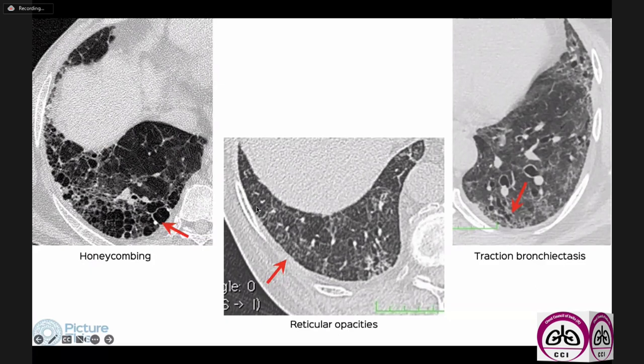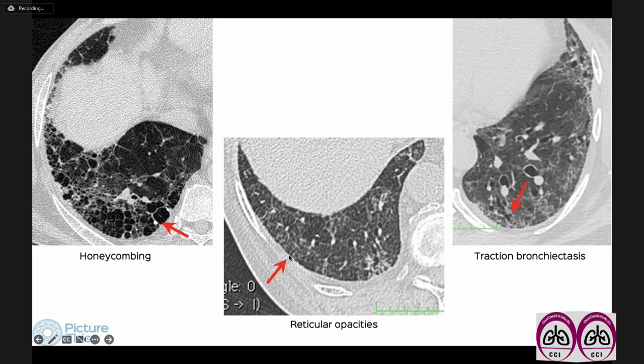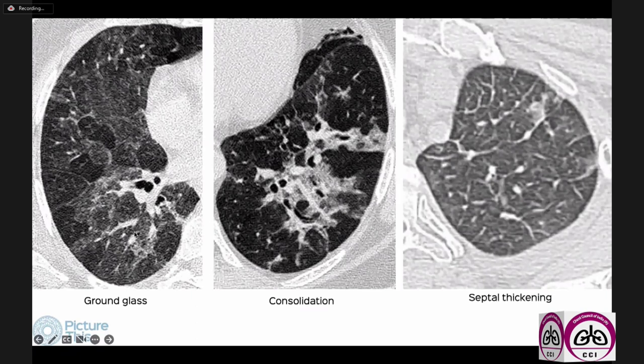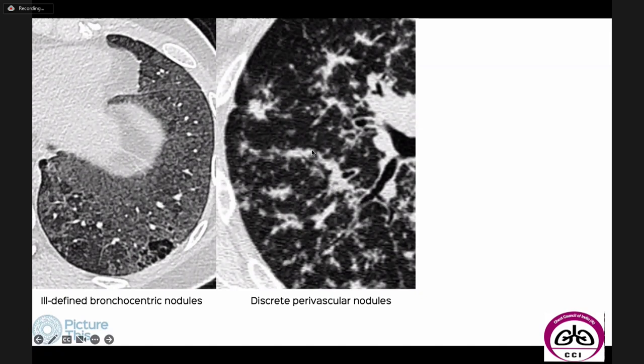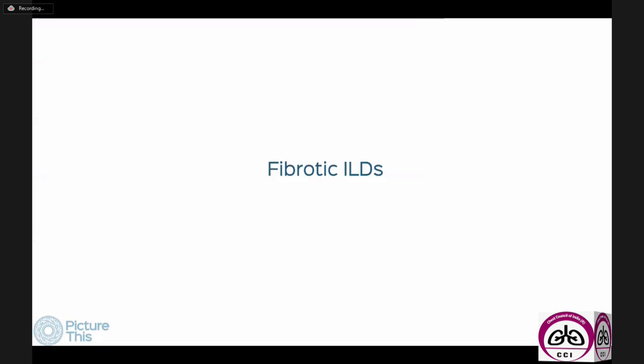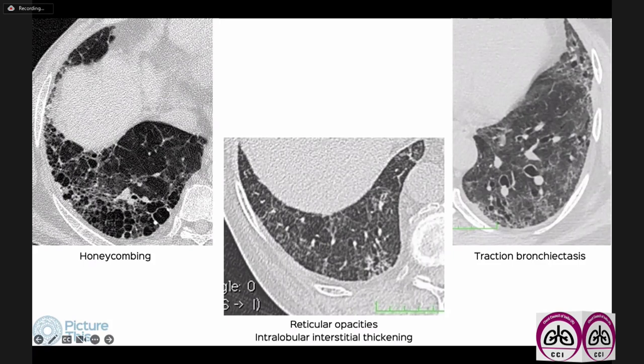When we talk about ILDs, we have about eight signs to look at. Three are signs of fibrosing ILDs: reticular opacities, traction bronchiectasis, and honeycombing. The signs of non-fibrosing ILDs are ground glass, consolidation, septal thickening, ill-defined bronchocentric nodules, and discrete perivascular, subpleural, or fissural nodules.